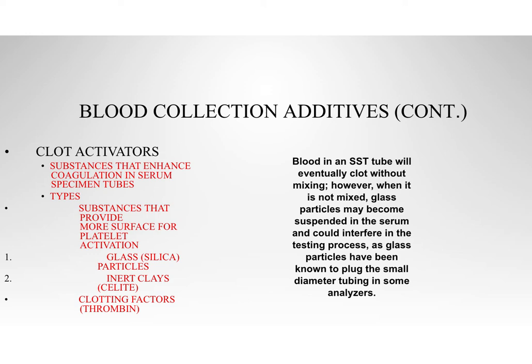Okay? So blood in an SST tube or a serum separator tube, and we'll talk more about those later, will eventually clot without mixing. When it's not mixed, however, the glass particles are going to get stuck, and it could interfere with the testing process.